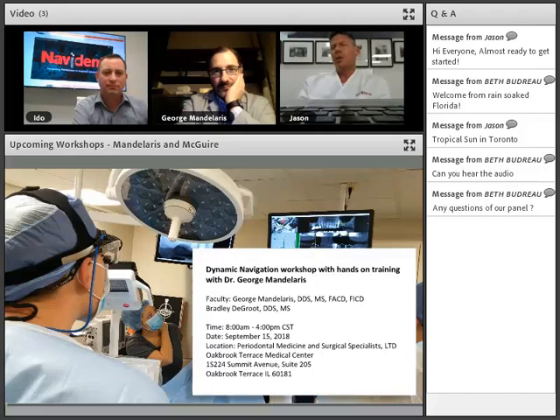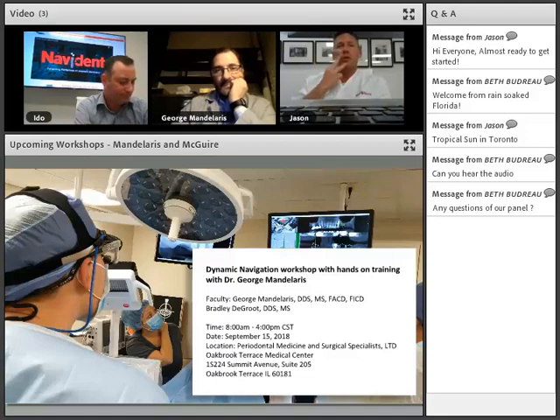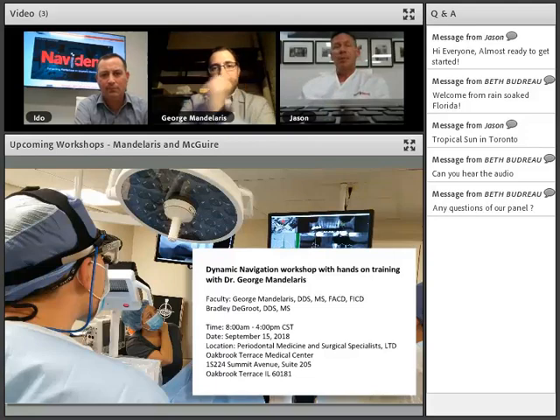So if you do 4, it goes up by, I believe, 0.3 or 0.4. So not super significant, especially if you're only placing 1 implant. If you're placing 1 implant, you pick 3 points very close to that implant area, trace those, and you're all set. If you're doing 7 implants and they're spread out around the entire arch, then we would probably encourage you to pick 4 or 5 points and do that.